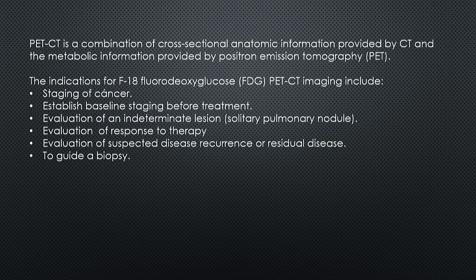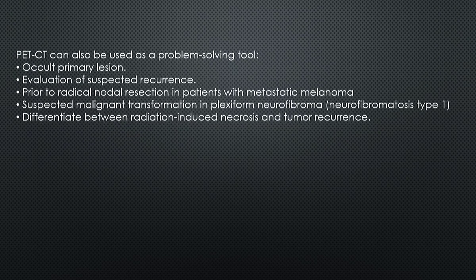Okay, PET-CT is a combination of the cross-sectional anatomic information provided by CT and the metabolic information provided by PET. The indications for this study are staging cancer, establishing a baseline staging before treatment, evaluation of indeterminate lesions, for example a solitary pulmonary nodule, evaluation of response to therapy, and suspected recurrent disease. And we can also guide a biopsy.